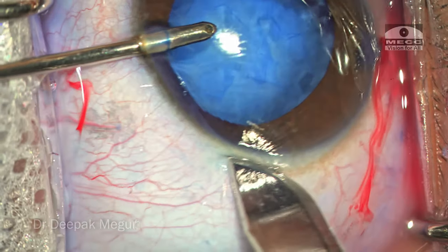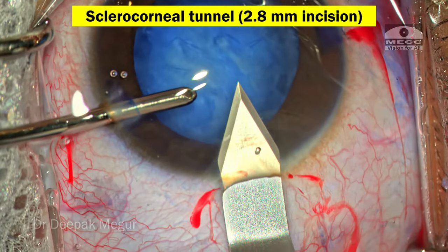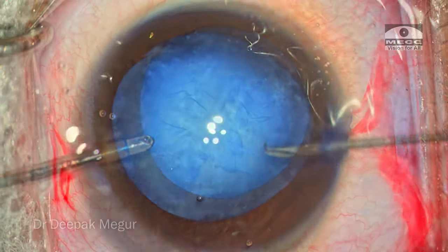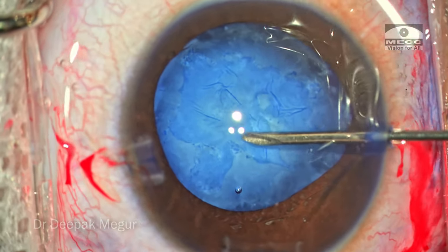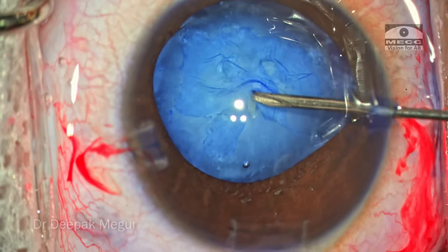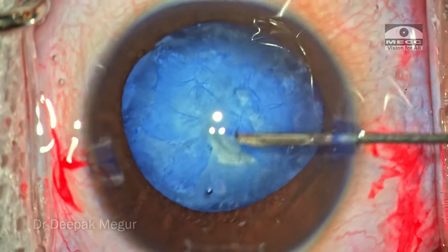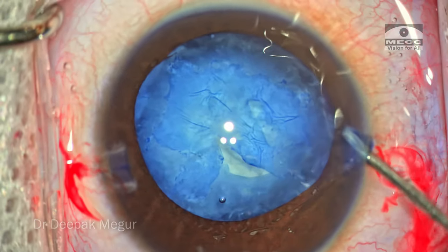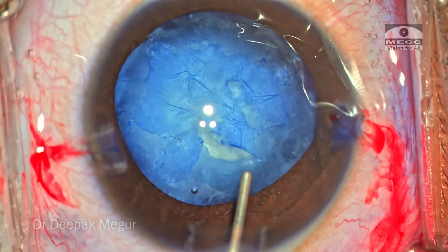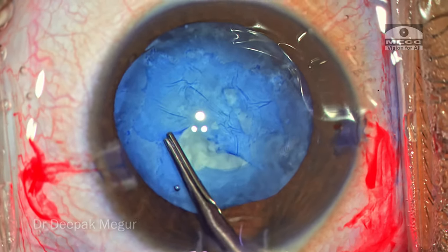I'm making a slightly scleral incision and then a sclerocorneal tunnel is created with a 2.8 mm blade and we enter into the eye. Because the capsule is fibrotic, I always try to first puncture the capsule with a 26-gauge needle, raise a flap, and then tear the capsule. The needle is much sharper than pointed forceps so I can puncture the anterior capsule in a better way. The flap is raised and using the forceps I'm trying to tear it.